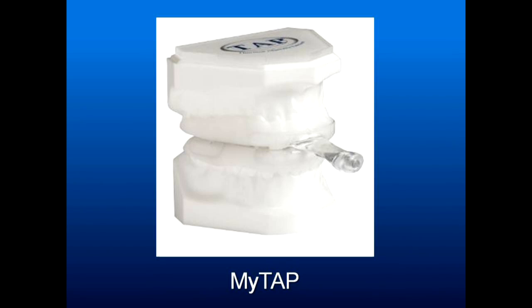The MyTap, it's a boil and bite appliance. You boil the upper appliance, put it in place, and it forms. You do the same thing with the lower, and then you titrate with a plastic screw coming through this piece. It is a good appliance when you need something immediately, or you need to see how someone responds.